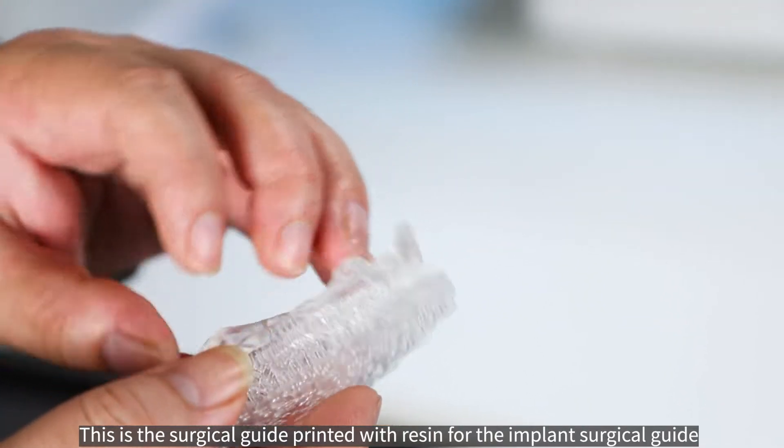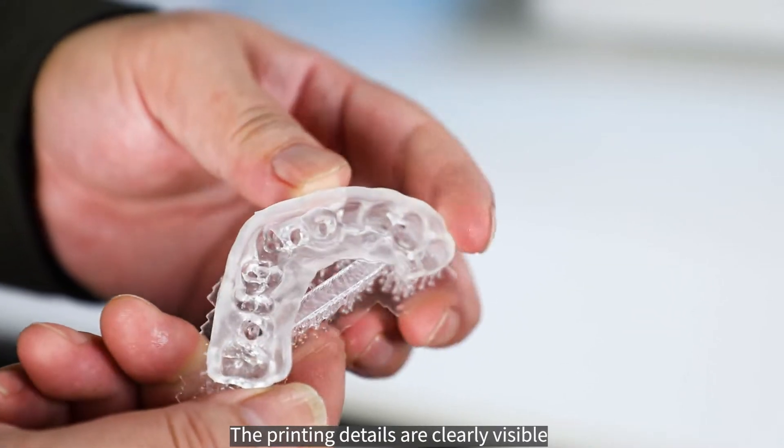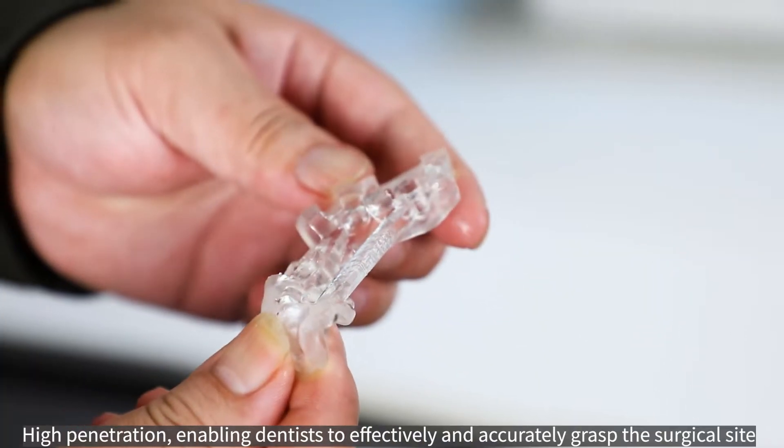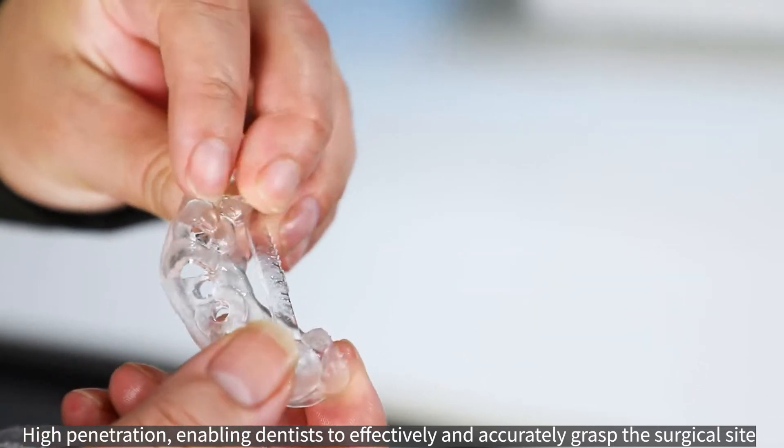This is the surgical guide printed with resin. The printing details are clearly visible and the printing size can be restored with high precision. High penetration enables dentists to effectively and accurately grasp the surgical site.